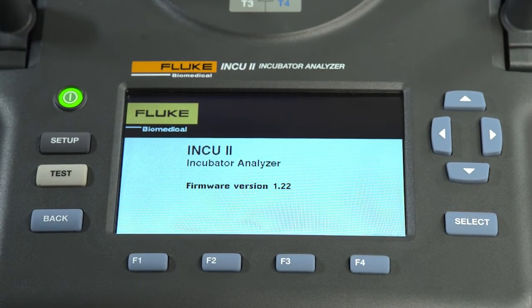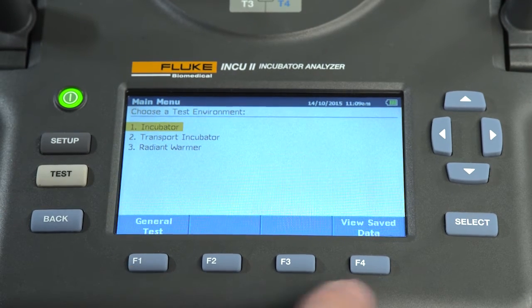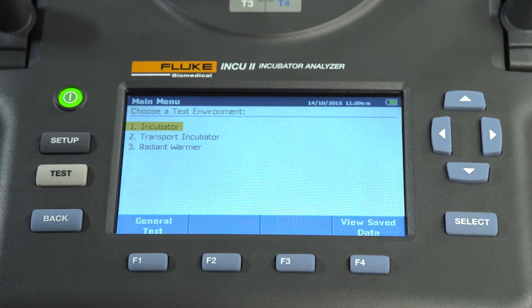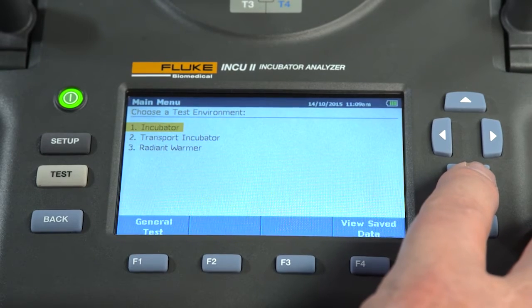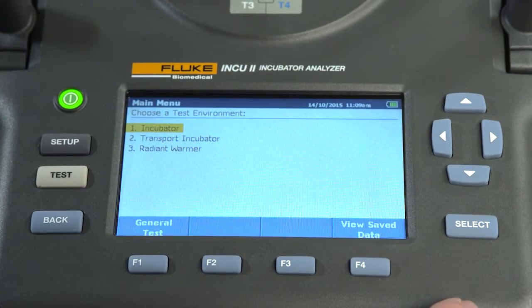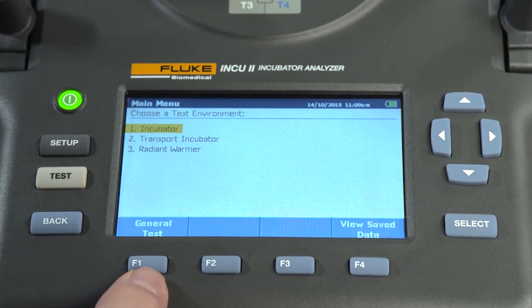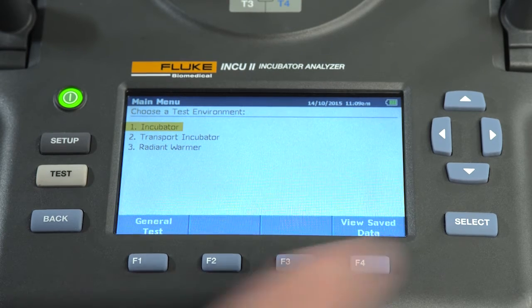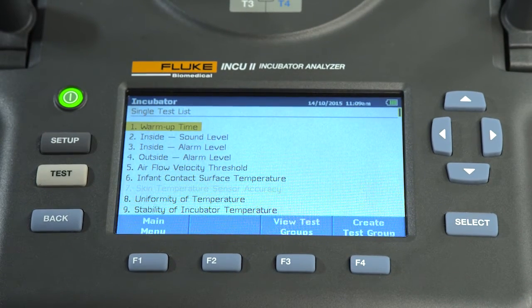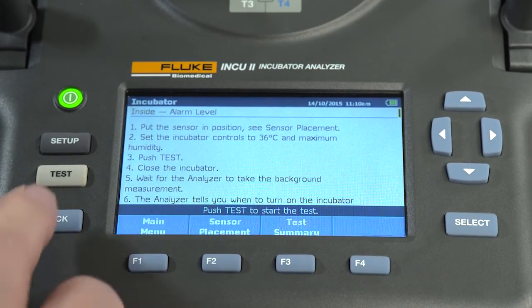When it's ready to test, the main menu will appear. Select a test environment and choose a general test or view saved tests. For example, if you're going to run an incubator test, highlight incubator from the test environment option using the navigational arrow keys and then press select. You can also choose the general testing option, which allows the user to log data without testing to a specific standard. But in this example, we're going to test to a standard. Let's choose the IEC standard we want to test against, follow the on-screen directions, then press test.